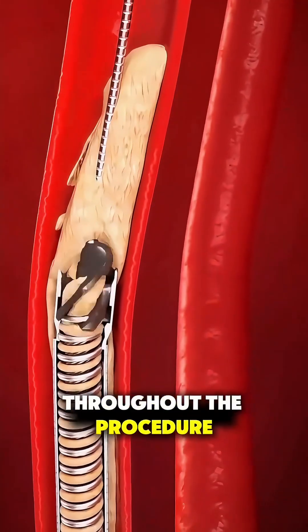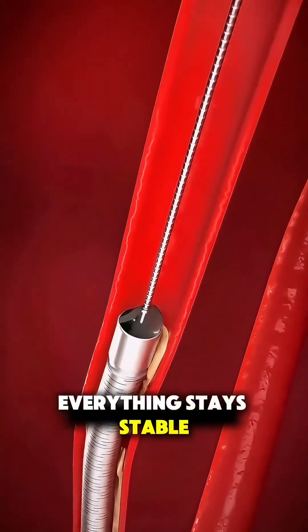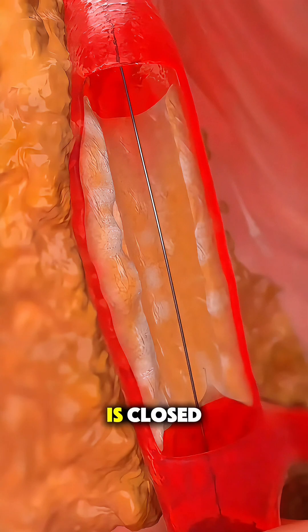Throughout the procedure, the team closely monitors blood flow and makes sure everything stays stable. Once the blockage is treated, the catheter is carefully removed and the blood vessel access site is closed.